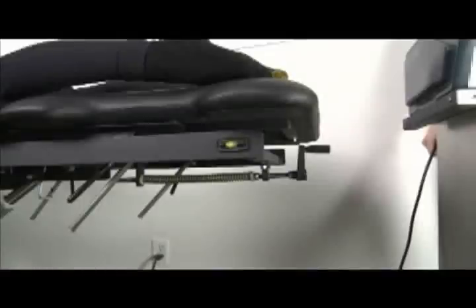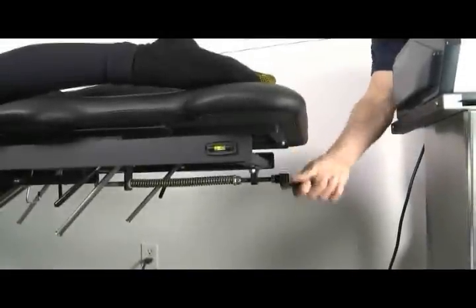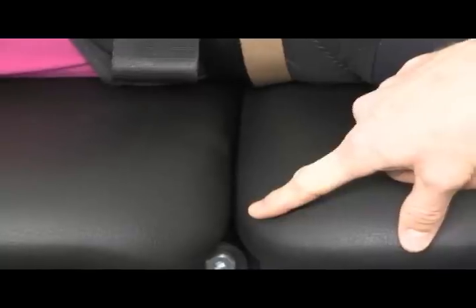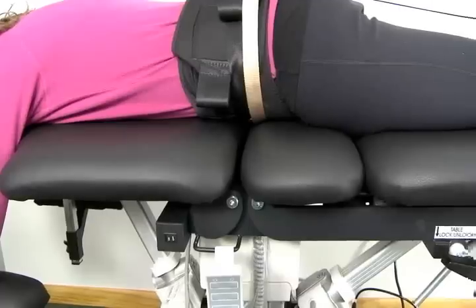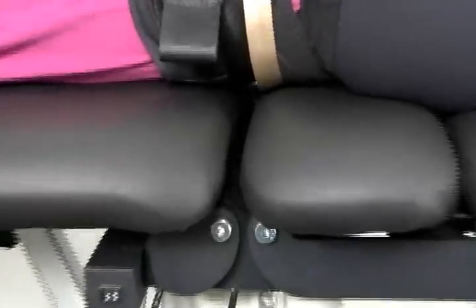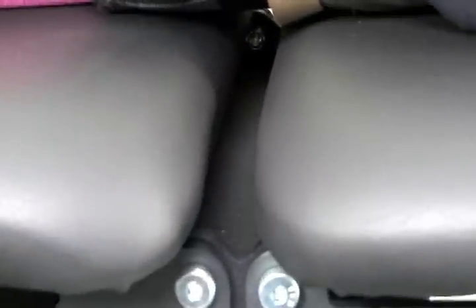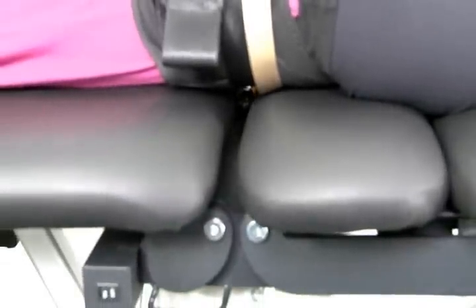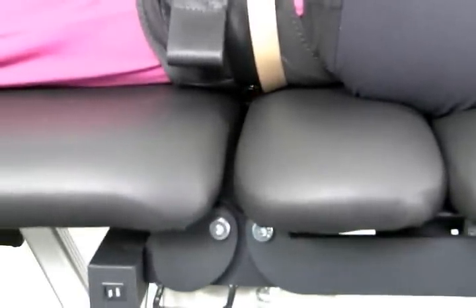A good place to start for most patients is at 40 pounds. You get 2 pounds per turn of the crank in either direction. Fully tension the spring by turning the crank clockwise until it stops, and then turn counter clockwise 5 or 6 turns to arrive at 40 pounds. At peak force, observe the movable split of the table. If the table is not opening, detension the spring counter clockwise until the table opens about a quarter inch. If the table opens too much, tension the spring clockwise until the table is only opening a quarter of an inch.